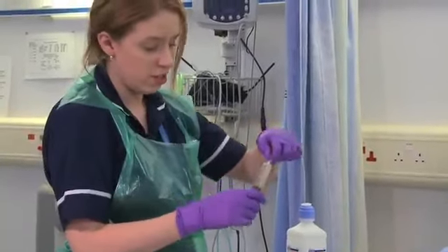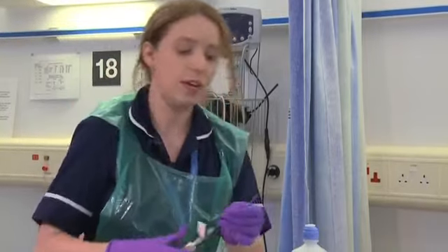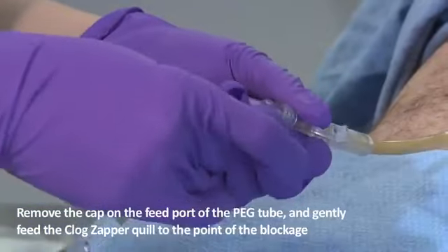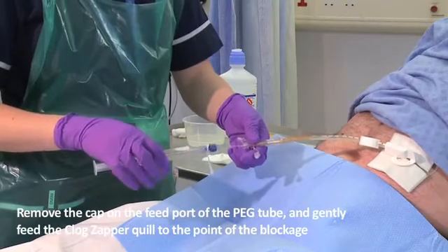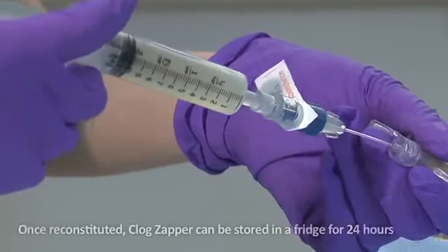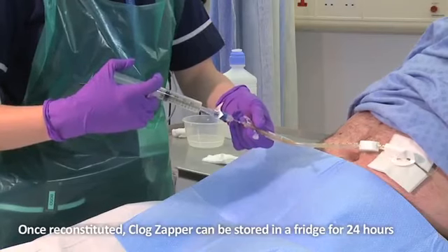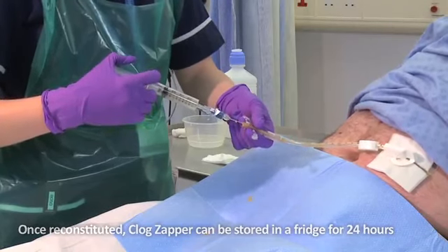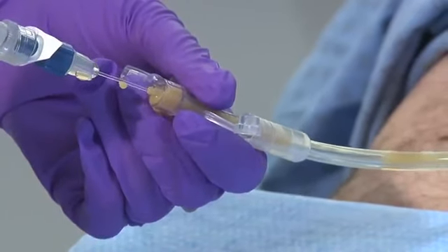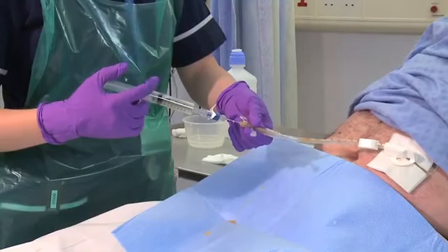So now we've reconstituted the clog zapper, we're going to put the quill on the end so that we can inject to the point of blockage in the tube. Then we can feed the quill down to the point of the blockage and then inject down just 2.5 ml, not the full 10 ml that's in the syringe. So we just inject in. We've got some backflow there, so the clog zapper's got to the point of blockage and it's just sitting there. That's just displaced anything that's sitting in the tube above that point.